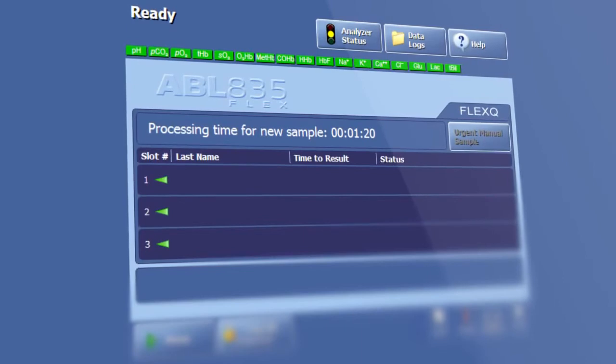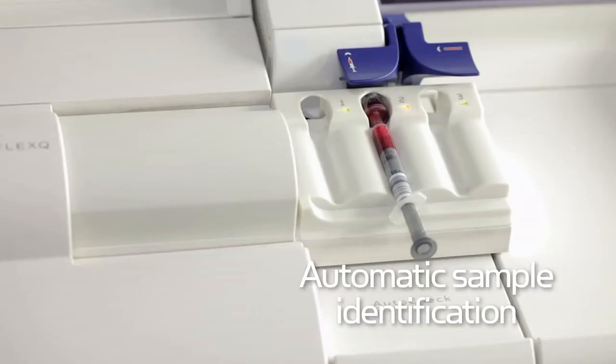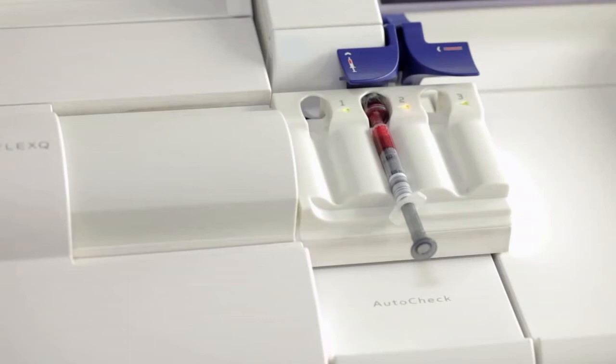Using the sampler ID, the analyzer retrieves sample and patient information. From the queue, the sample is automatically mixed and then measured.